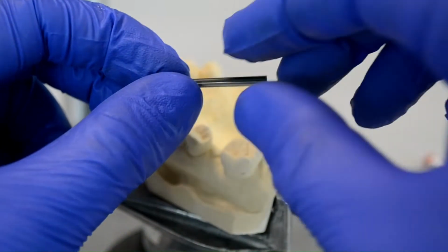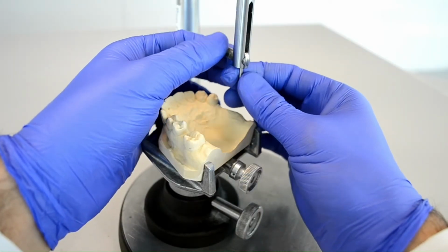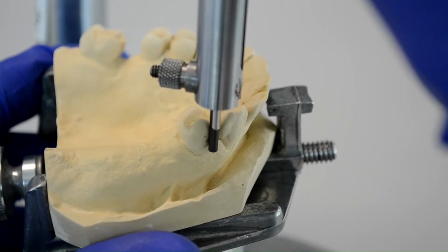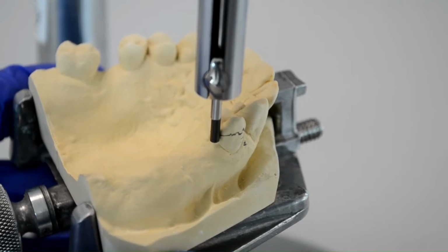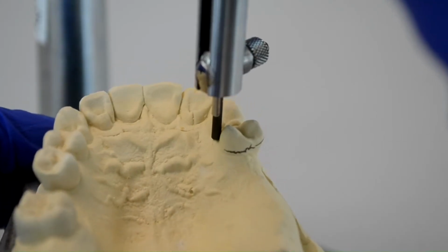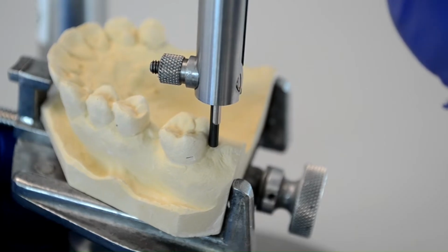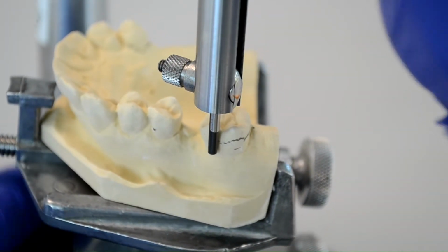This is done using the lead and the metal sleeve. They're both detached together and then attached to the mandrel. To correctly draw the survey line, we're going to ensure that only the side of the lead contacts the tooth and not the tip. The side of the lead is rubbed against the highest contour of each tooth, and that leaves a line called the survey line. Anything under that line represents a degree of undercut.